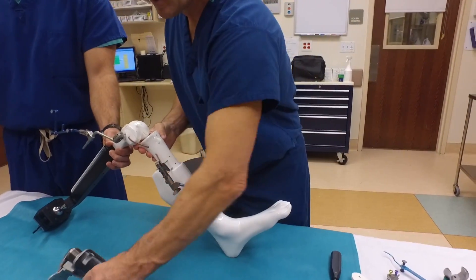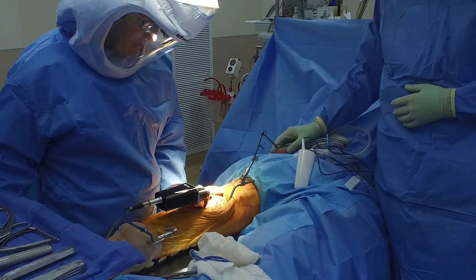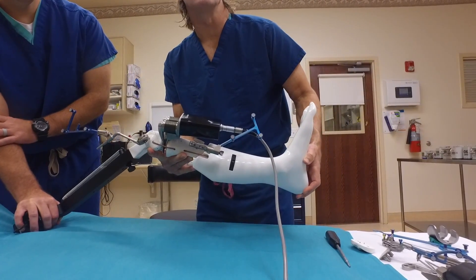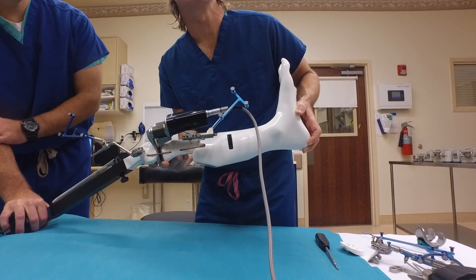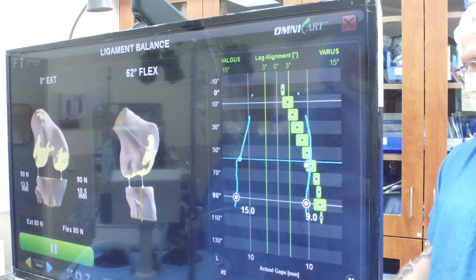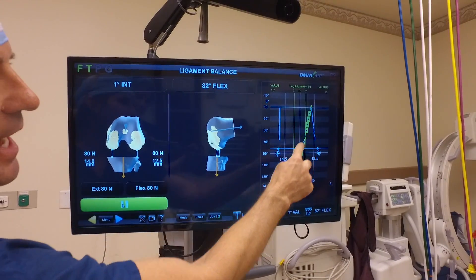We then bring in our tensioning device now that we've made that tibial cut. We place it between the bones and measure the ligament tension — the medial side versus the lateral side — to help us balance that knee. We take it from flexion out into extension and let the computer measure those gaps. Looking up at that screen, I can see how many newtons of force it takes to get an extra millimeter gap. We're giving the computer perfect information. So we have a 14 here and a 13 here — we can get all our readings as to how we're moving.